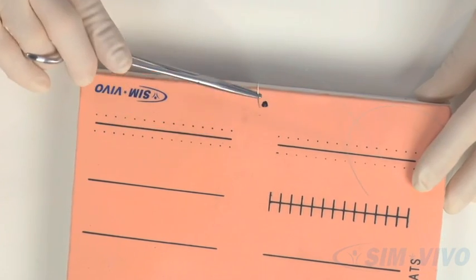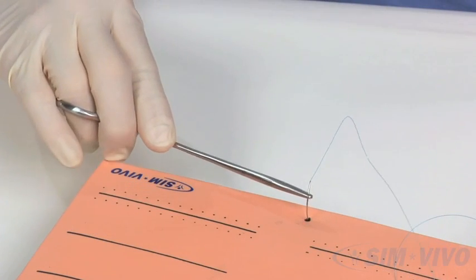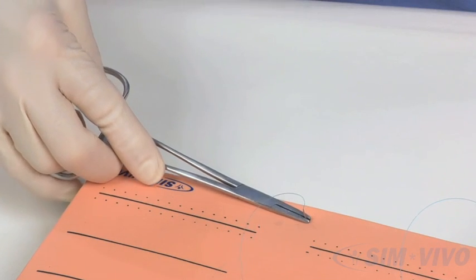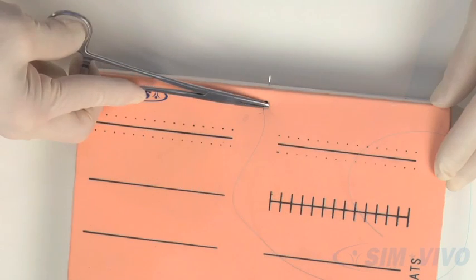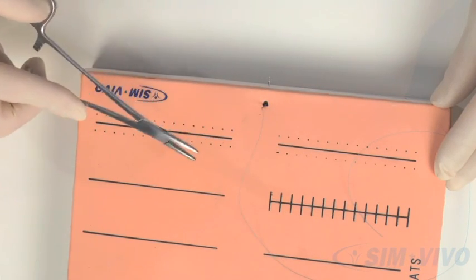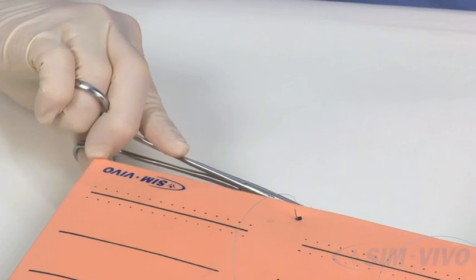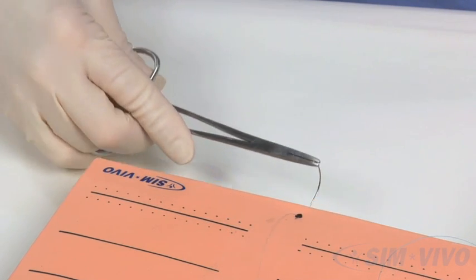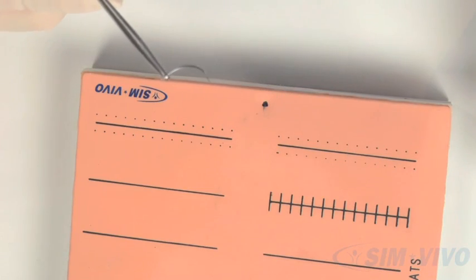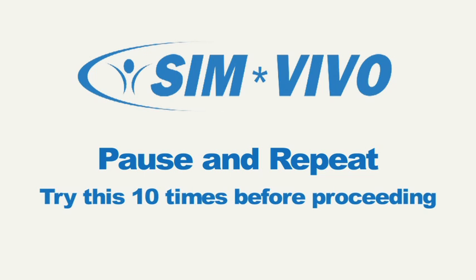Enter the skin perpendicularly. Rotate your wrist to follow the curve of the needle. Release the needle. Re-grasp the tip of the needle in a perpendicular direction. With a slight pull on the needle, continue the rotation of your wrist until the needle exits the foam. Pull the rest of the suture through. Here is your first assignment. Pause the video and repeat this exercise 10 times.